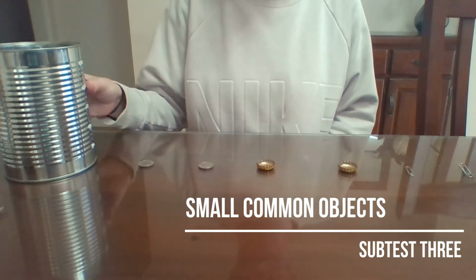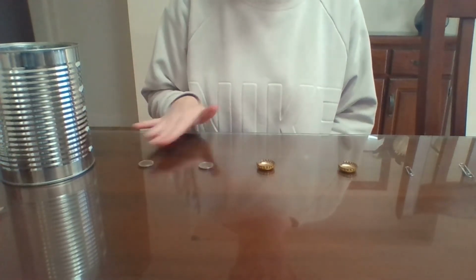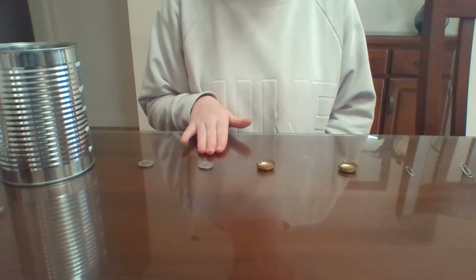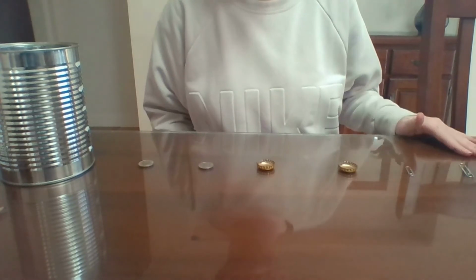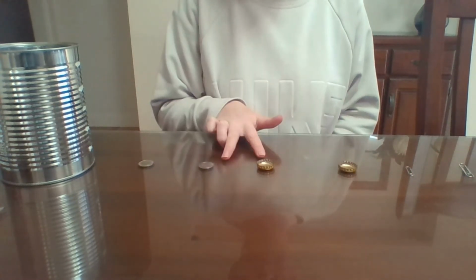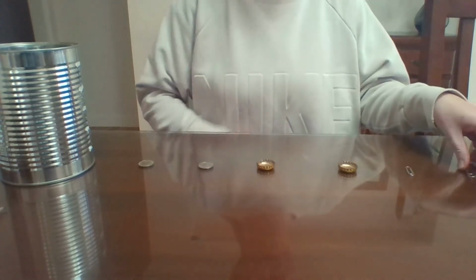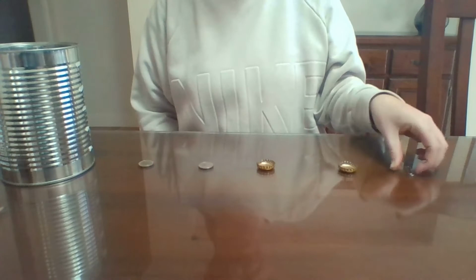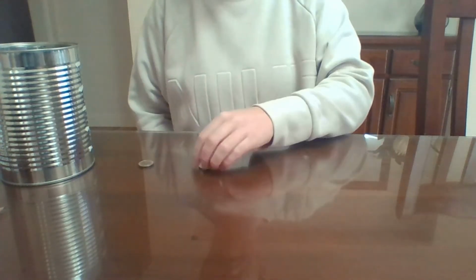A large coffee can is placed 5 inches away from the edge of the table. 2 10-cent pieces are placed next to the can in a row, followed by 2 bottle caps and 2 paper clips. They each should be 2 inches apart. The assessor times how fast the participant can pick up the objects, starting with the furthest item, the paper clip. Complete the assessment again, setting the items out on the opposite side of the can with the dominant hand.